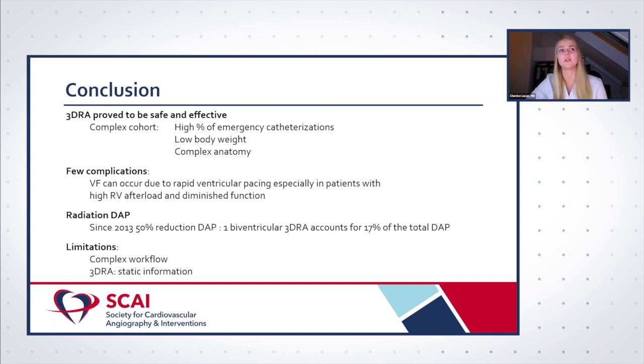In our opinion, rapid pacing is essential to decrease contrast flow by reducing cardiac output. However, if the cardiac output is already decreased in patients due to poor ventricular function, then rapid pacing might be unnecessary, but that's only in these indications.